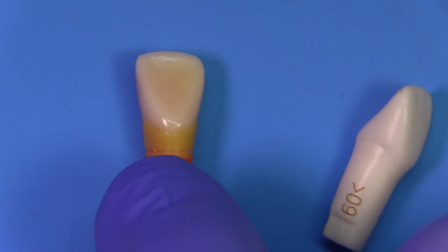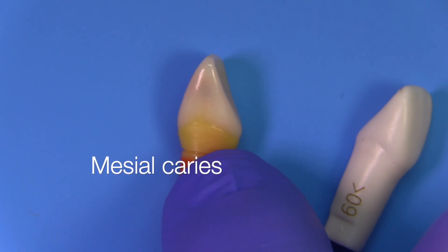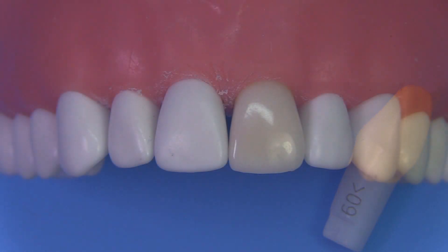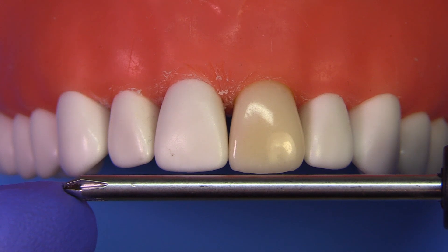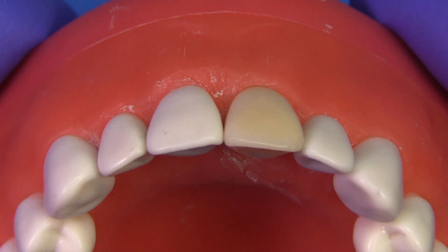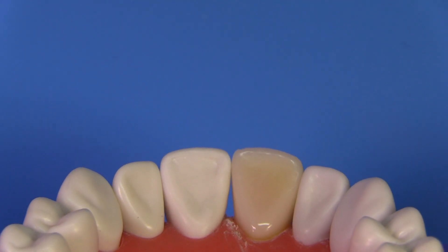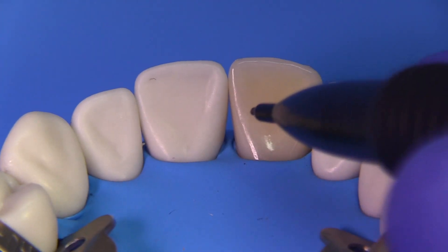You can see the teeth are essentially the same shape, but there are multiple layers in this caries tooth and it has mesial caries. It has a pulp, it has dentin, it has enamel — and the enamel is pretty hard. When it's mounted in the typodont it is just slightly longer than the adjacent tooth. I checked a couple of times to make sure I hadn't mounted it wrong, and it is indeed slightly longer as viewed from the facial, but it looks really close to being a carbon copy of the original tooth.